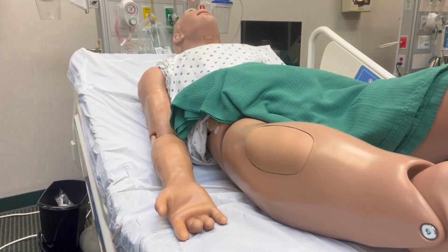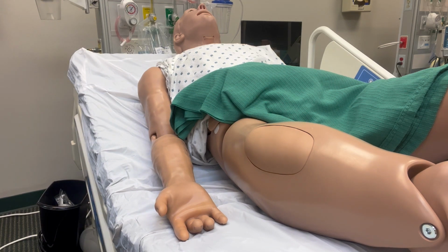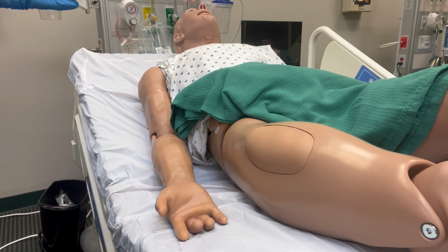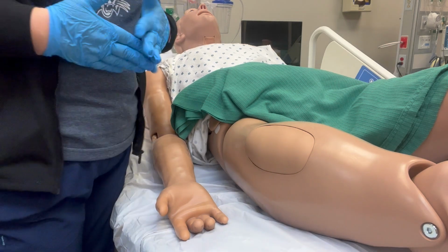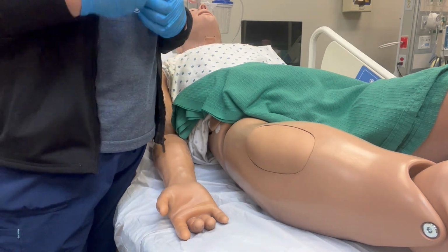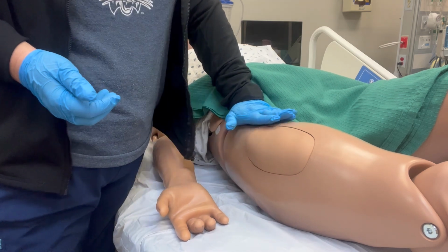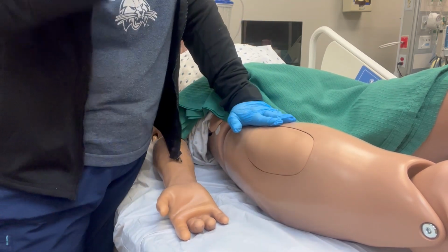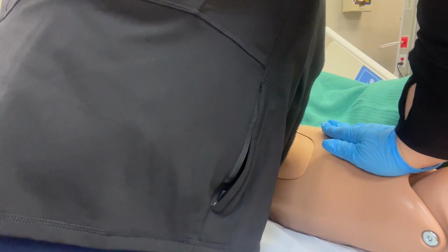Now, the site that is similar to find, only a little different location, is the vastus lateralis. So we're going to do the exact same thing in order to find the vastus lateralis. We're going to put this hand on the greater trochanter and this one on the lateral femoral condyle.